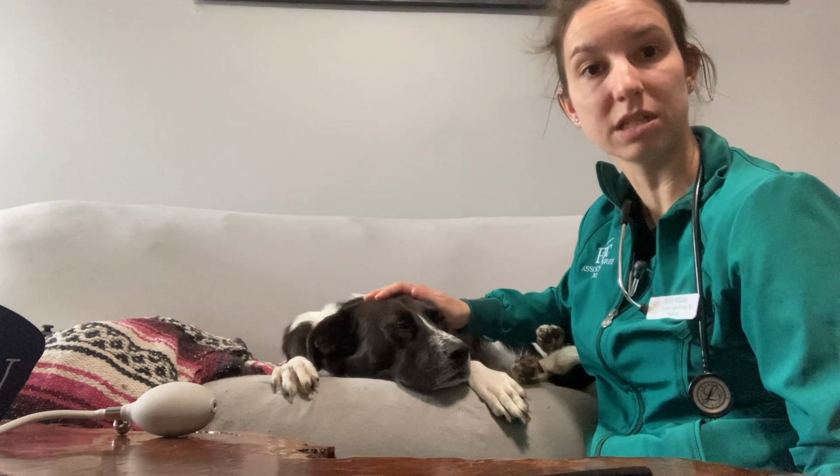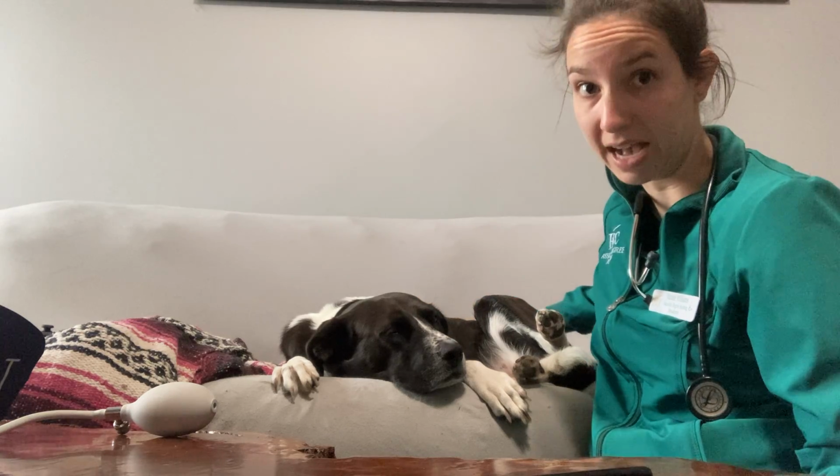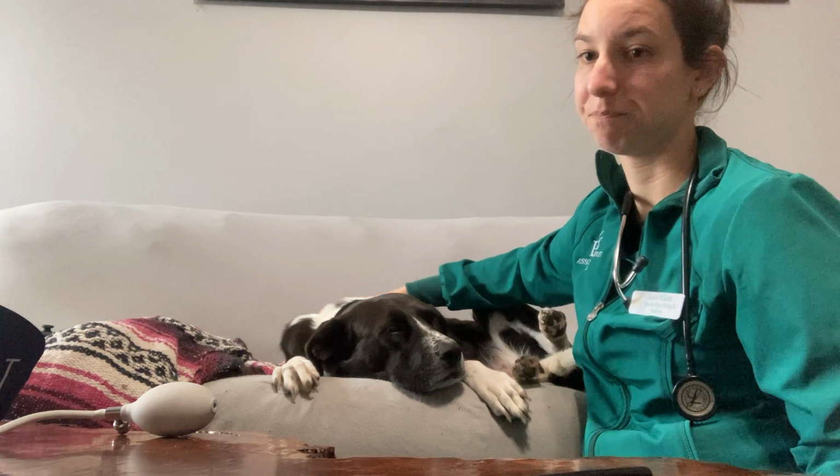That would definitely be time to let the provider know. That would also be a good time, if this was taken electronically, to get a manual blood pressure and verify that that was in fact an accurate reading.